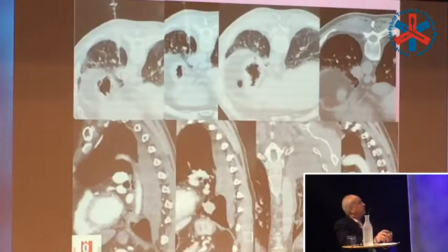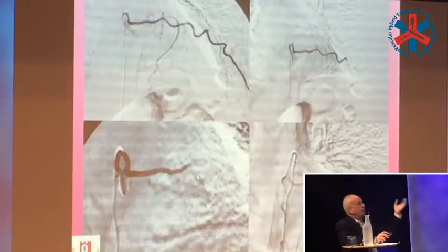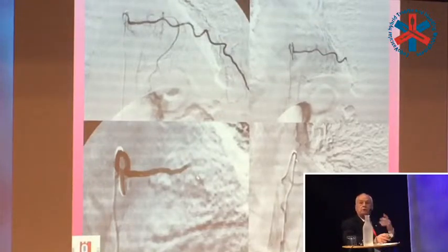Thoracic biopsy, followed by a massive hemothorax. We selectively catheterize all the lumbar and intercostal arteries, and even if we don't see bleeding, we embolize empirically with gel foam. By the way, we prefer gel foam because of its recanalization, and most of our patients are young, so it's better for them.